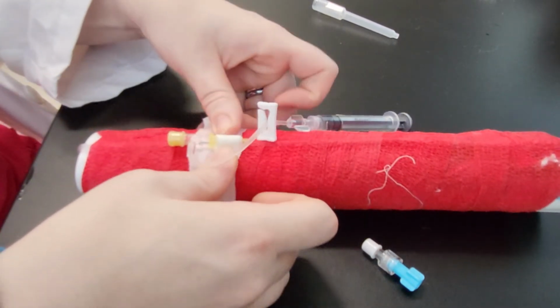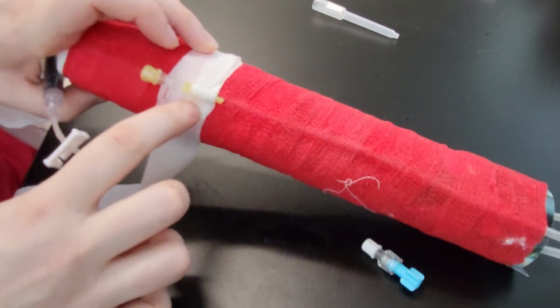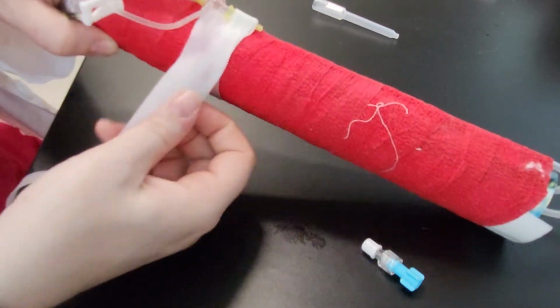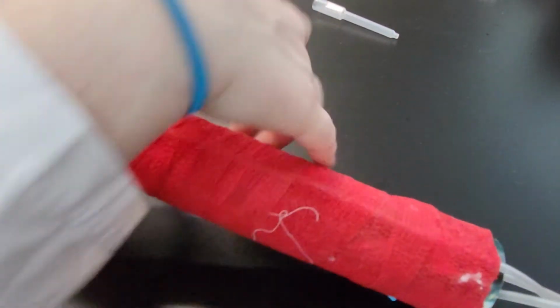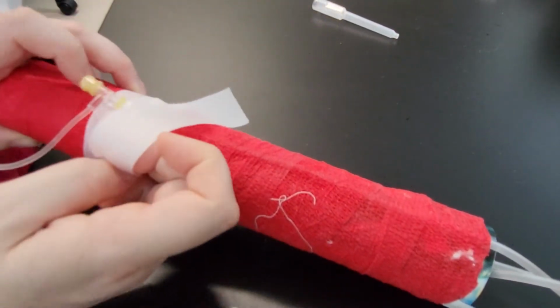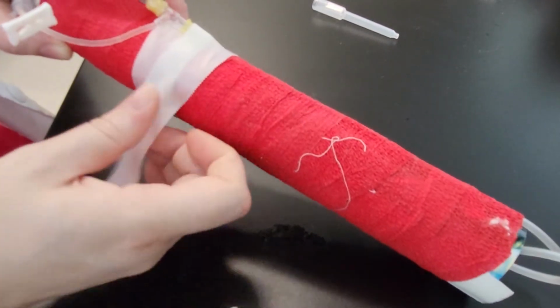you've placed previously. So at this point, you've got your second piece of tape snugged up underneath the catheter hub on top of the tape that you placed first, and then you're going to wrap your tape around. This is the point where you can cover the insertion site of the catheter with this piece of tape.